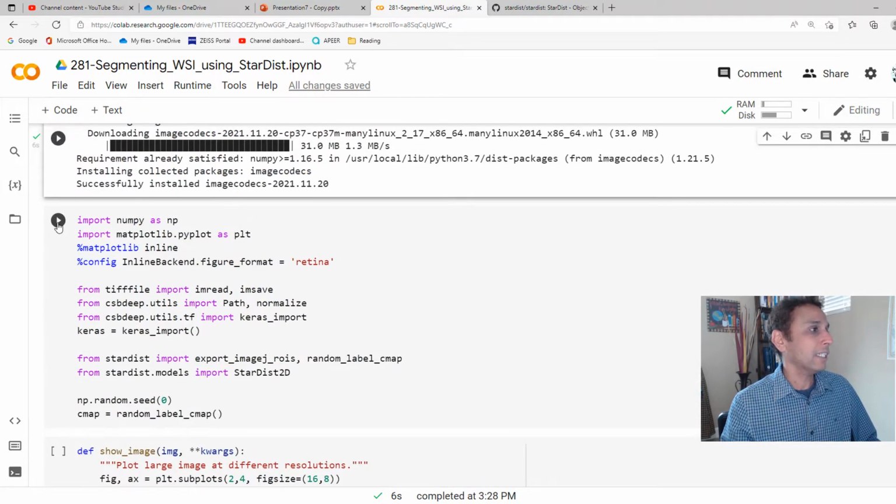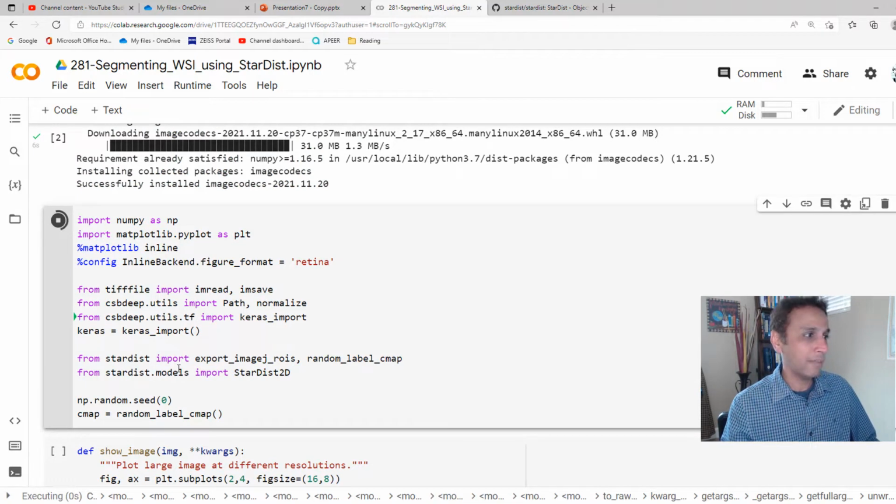And the next set of lines of code, again, if you watched my last couple of videos, you probably recognize many of these.